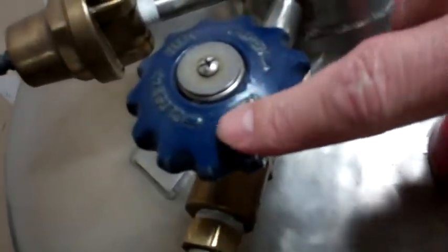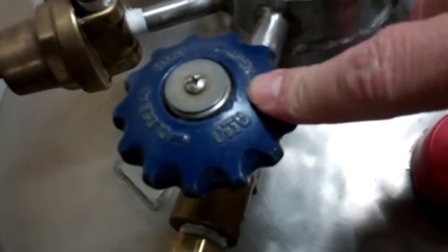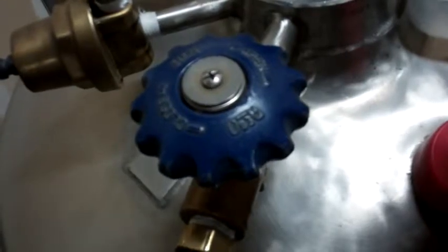The valve is labeled open and closed. Open it all the way and then turn it back one turn so that it doesn't get frozen open.